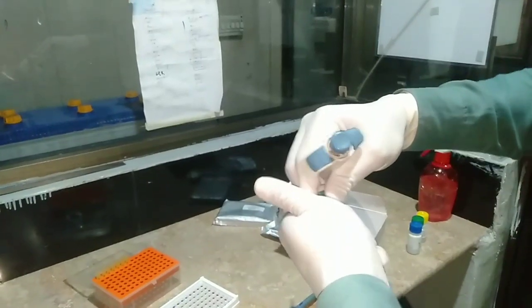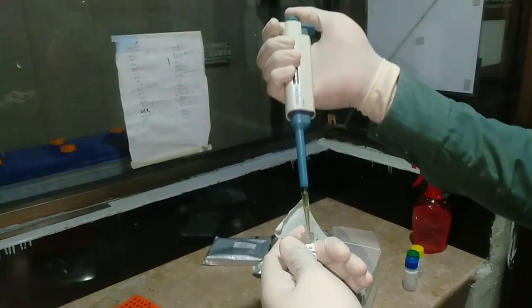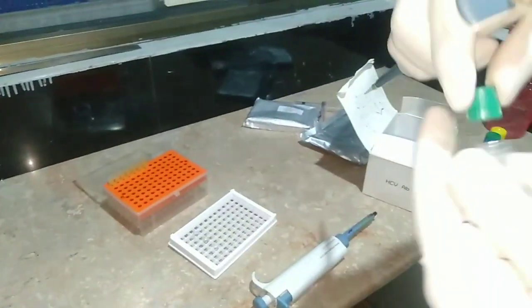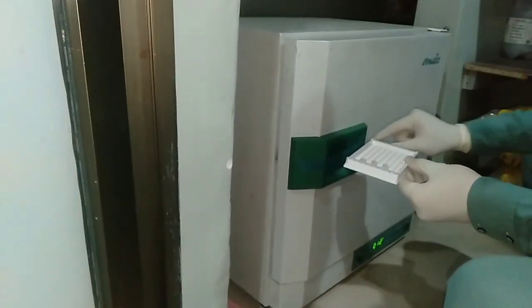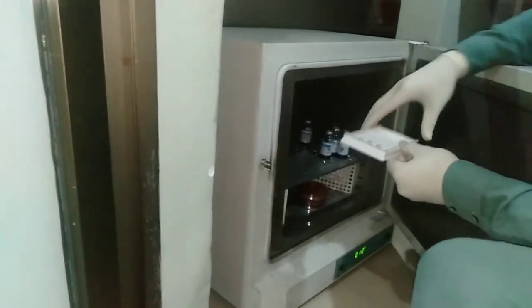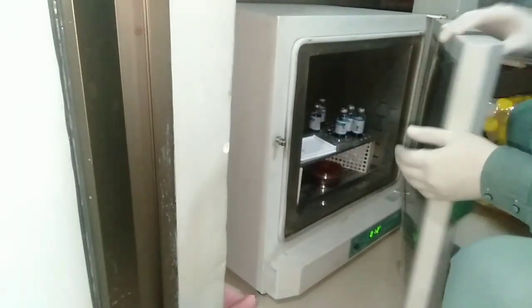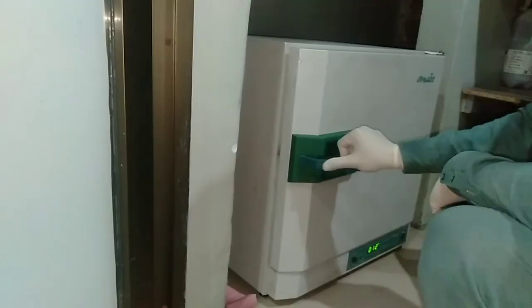Similarly, we take 10 microliters of the negative control and put it into the third well, which acts as the negative control. After this process, we incubate the micro titer plate at room temperature or in the incubator. After 30 to 60 minutes of incubation, we proceed to the next step.